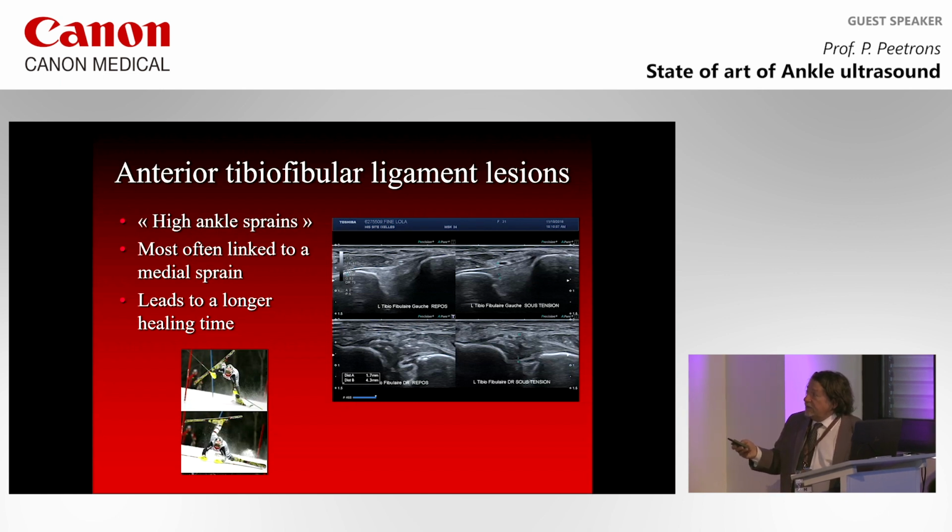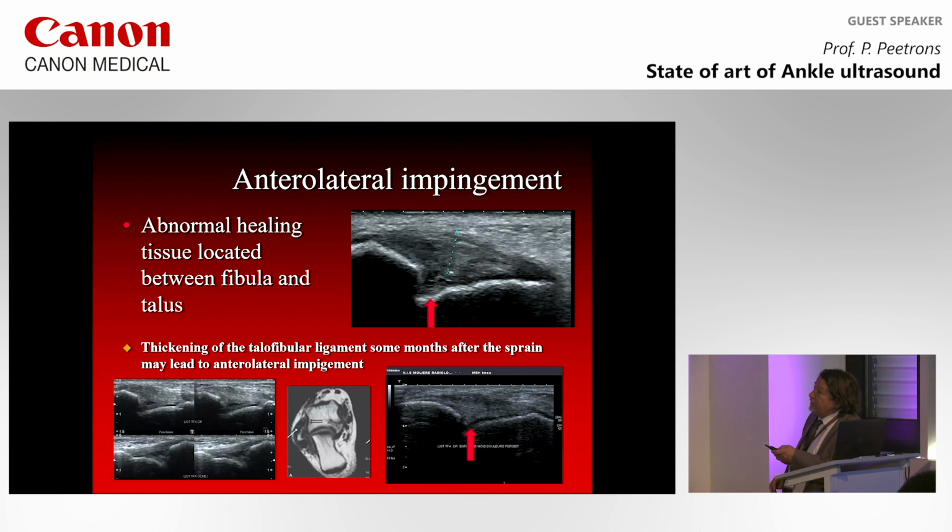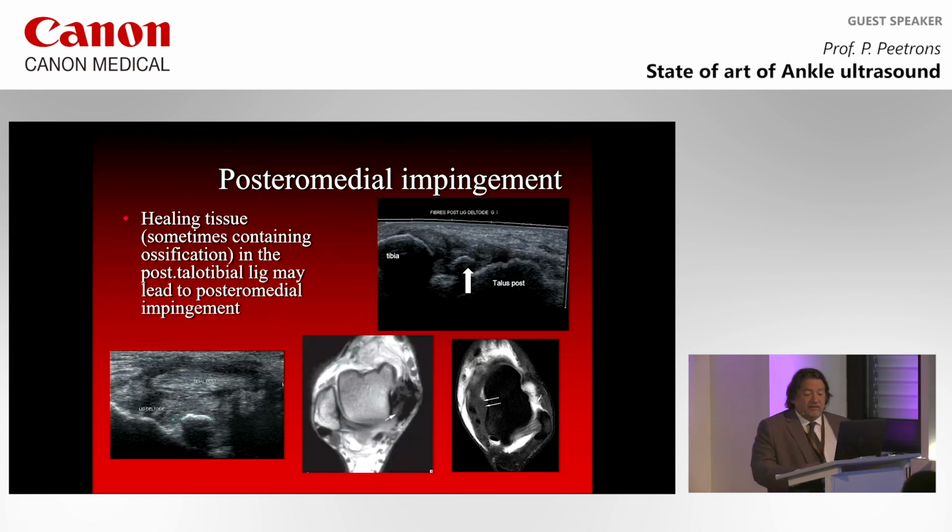And this is an example here with tension and without tension. So clearly abnormal compared with the normal one of this inferior tibiofibular ligament injury. So we have already discussed the anterolateral impingement. This is an abnormal healing tissue located between the fibula and the talus. So thickening of the ligament, we have seen it.